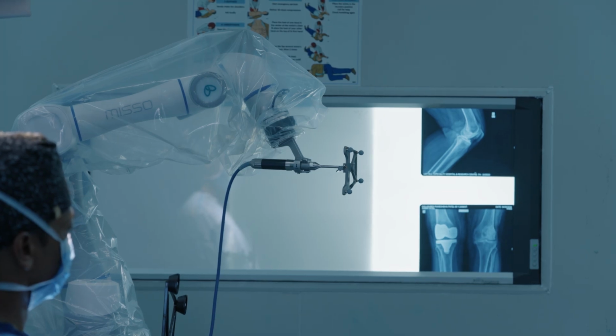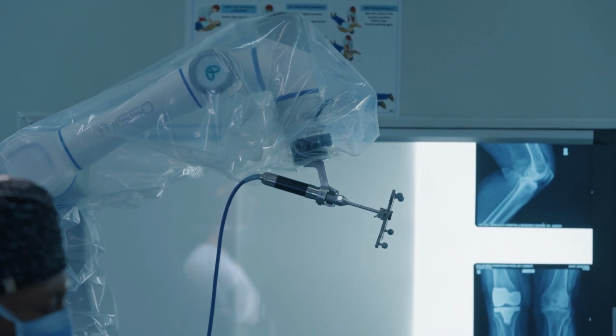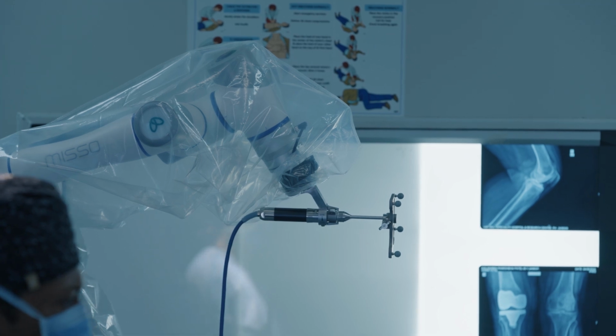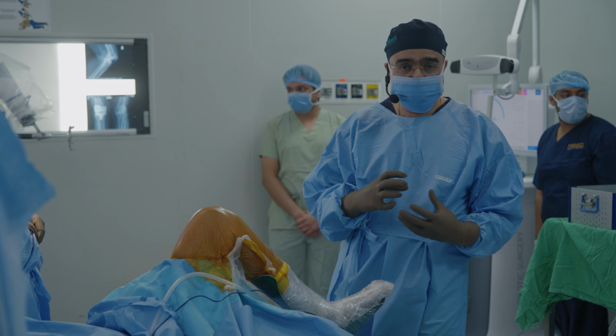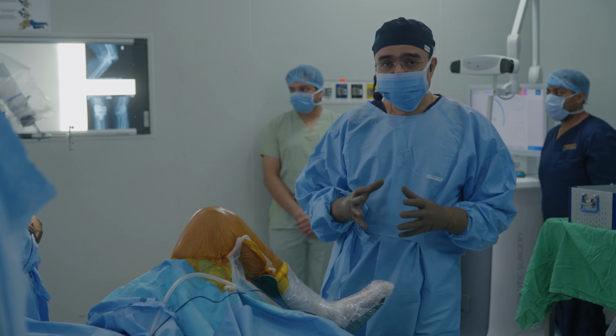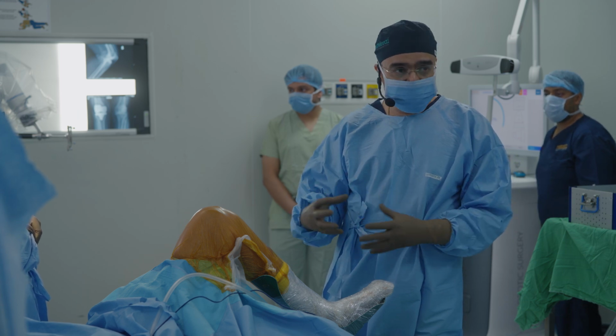So this is a CT based robotic system where pre-op CT planning is done and that plan is loaded to the robot, and before each and every case the robot will calibrate for that particular case, and this takes around 10 minutes. So once the calibration is done, the robot is ready and then we can proceed with the case.